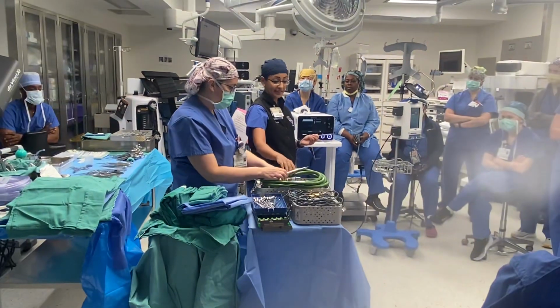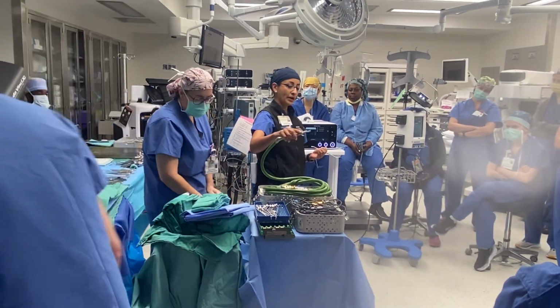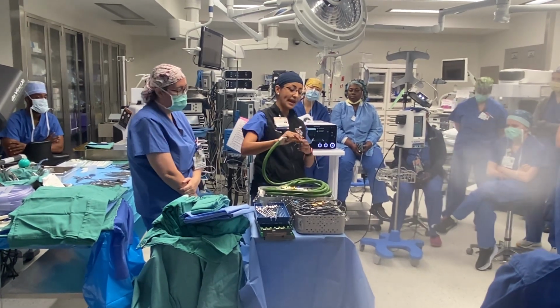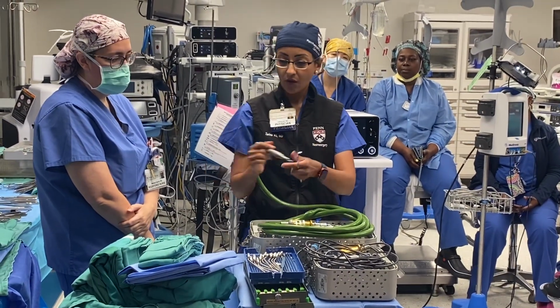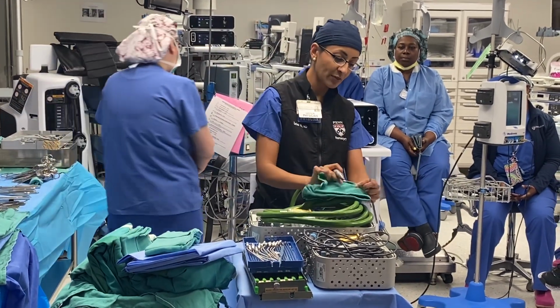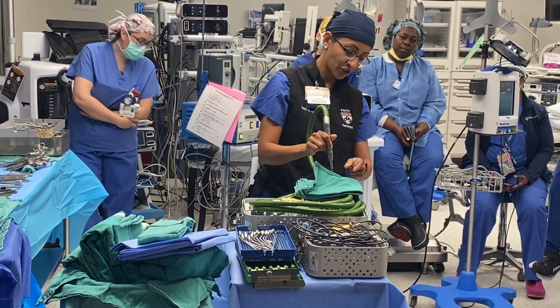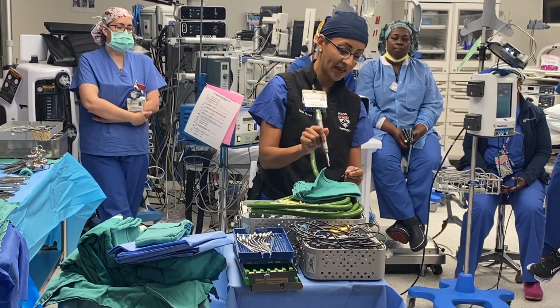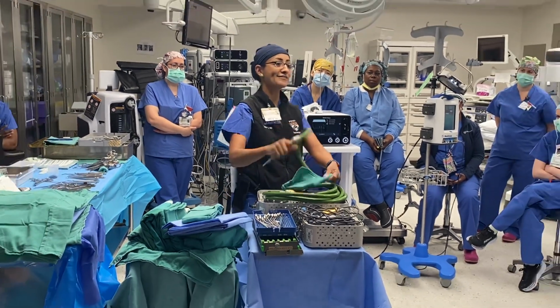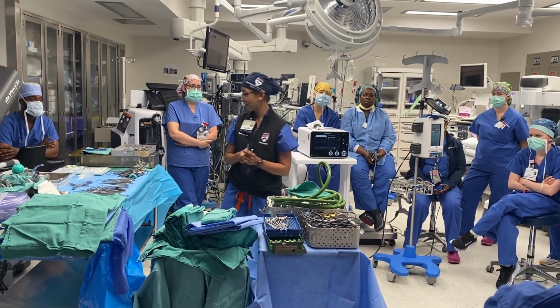While we're doing that, it's helpful for you to take that drill back and then put on this next drill bit, which is the B1 with the foot plate. And what this allows is, after we've done that dissection, since we've already dissected the skull from that inner layer, now you can actually put this foot plate into that space, and then we will turn our craniotomy flap. Everyone who does this knows this. Everyone's holding that cranie. You certainly don't need craniotomy falling on the floor.